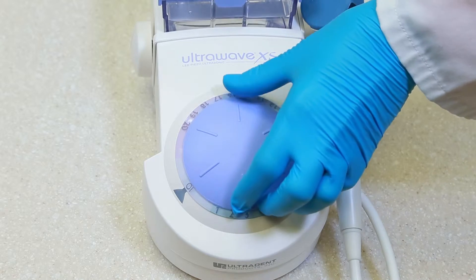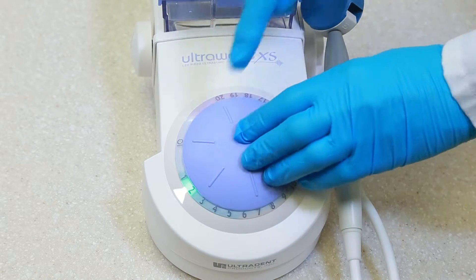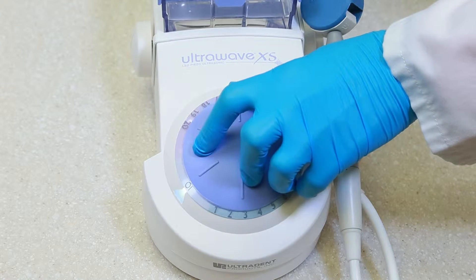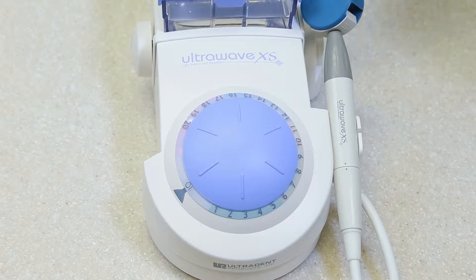Once you've confirmed your ultrawave XS is plugged in, make sure that the dial is in the on position. That can be verified by an audible click and the illumination of the dial.